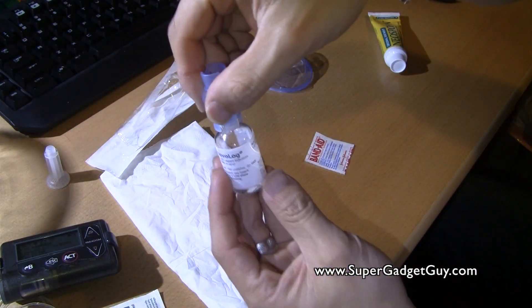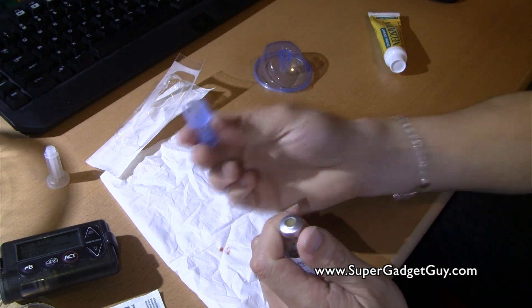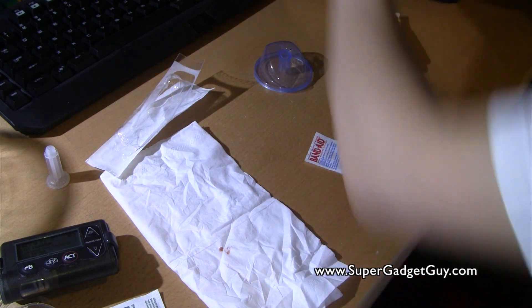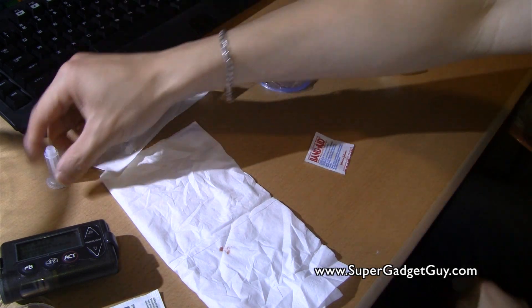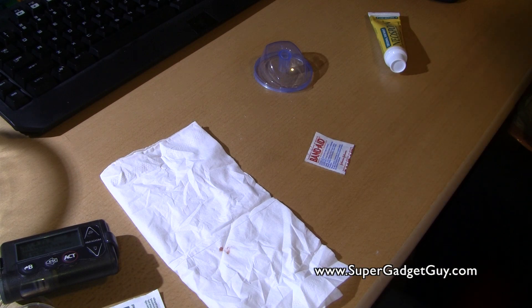Now I put the insulin away, unplug this, throw the old tubing in the sharps container, put my insulin back in a safe spot so I won't drop it, and the back of the plunger and the old reservoir set go in the trash.